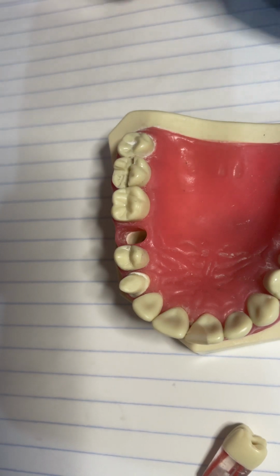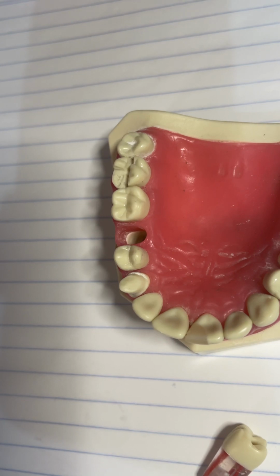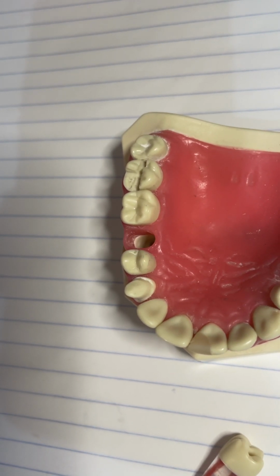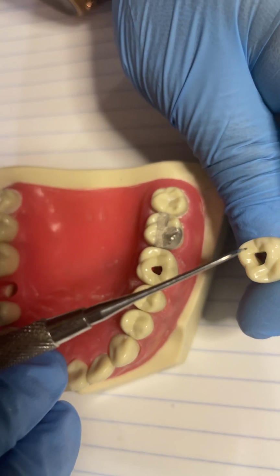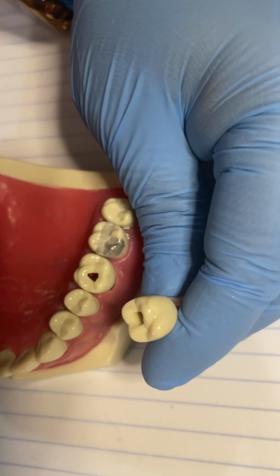So what we need is very simple. We need just the round bar, Endo Z bar and needle bar, those 3 bars only, and then slow speed round bars, all sizes, the ones mentioned in the ADC handbook. I think it's starting from 010 to 016. You don't need the largest one, but for the endo cavity, just to smoothen out the corner, I think 010 is too small, but you can use like 012 or 014.